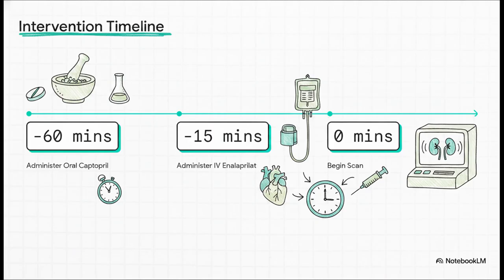And during this waiting period, you absolutely must record the patient's sitting blood pressure every 15 minutes. Remember, we are deliberately dropping their compensatory mechanisms, so keeping a very close eye on their vitals is critical before hitting time zero and firing up the scan.